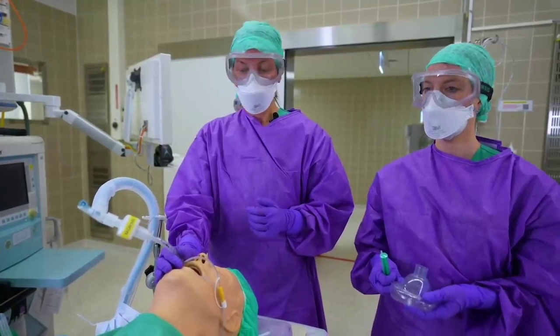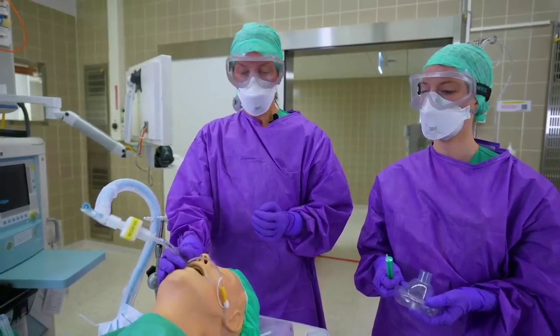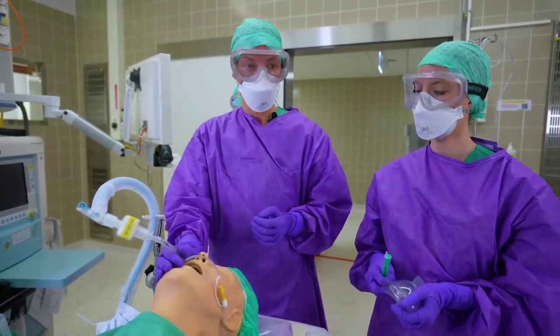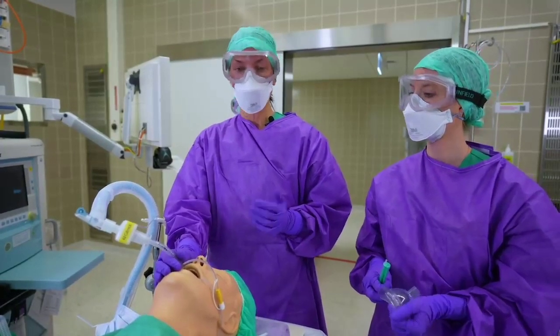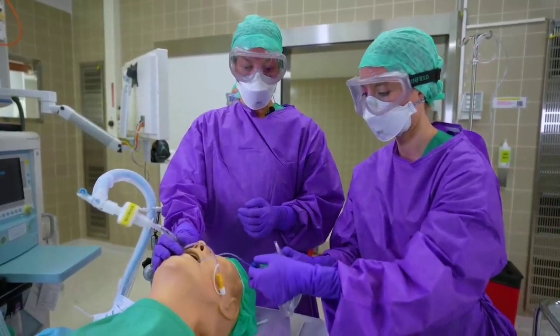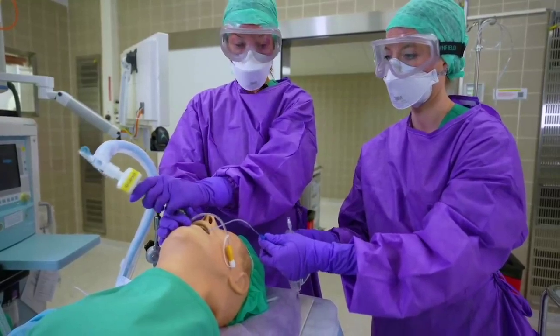It is important to avoid coughing when you extubate the patient. IV lidocaine or remifentanyl come in handy. When you extubate, you're not utilizing positive pressure, but rather you're deflating the cuff and pulling the tube.